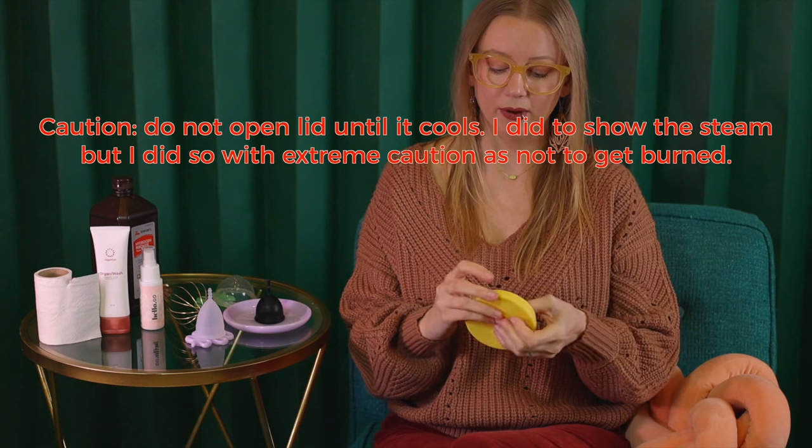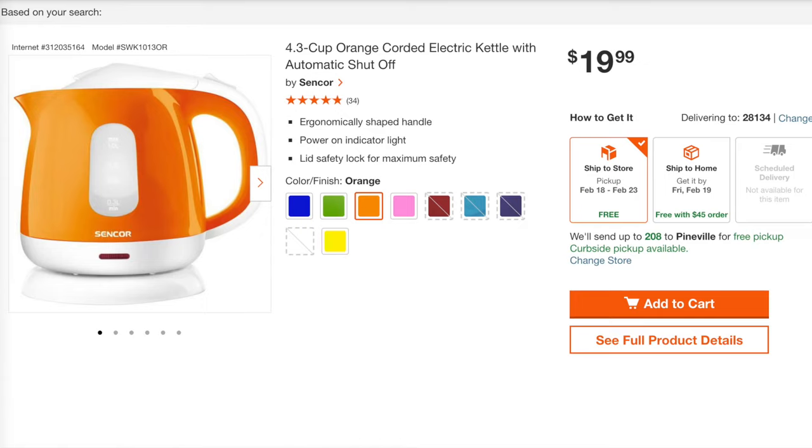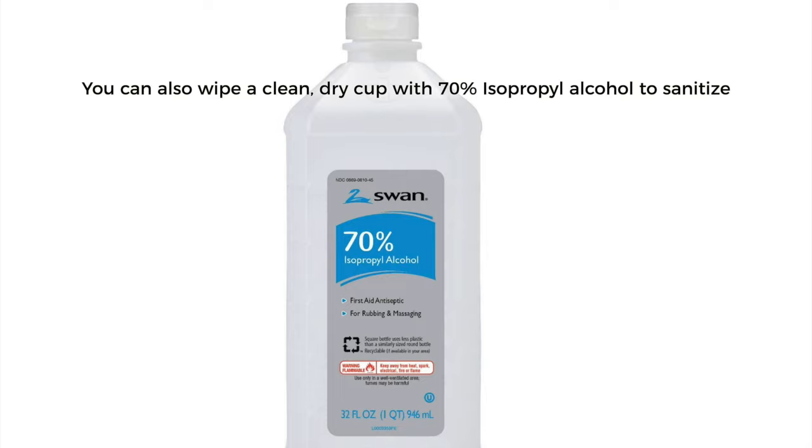I've heard people say, okay, I live in a dorm and I don't even have a microwave — what do you do? Electric kettles. You can get that water going real hot, put your cup in a mug, and pour the water over the cup. Same thing for Keurigs — I've heard people use Keurigs. So we've got a few options, but let's talk about boiling.